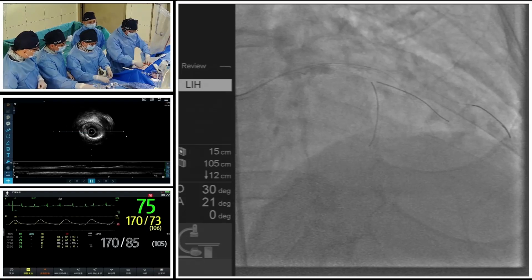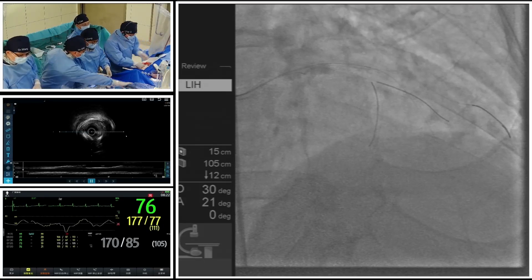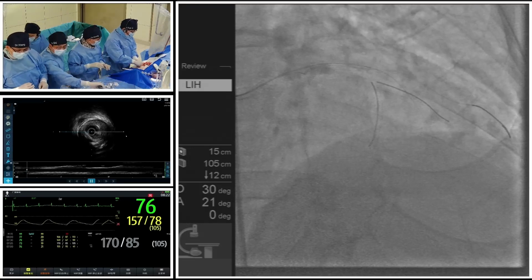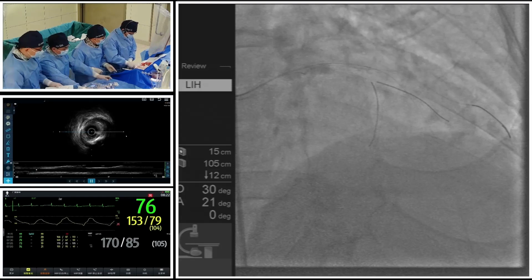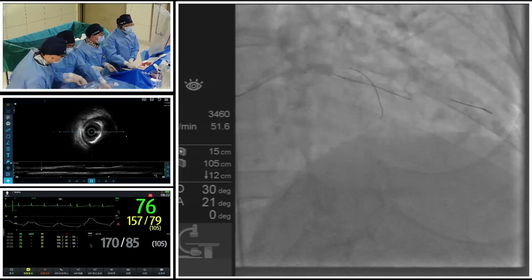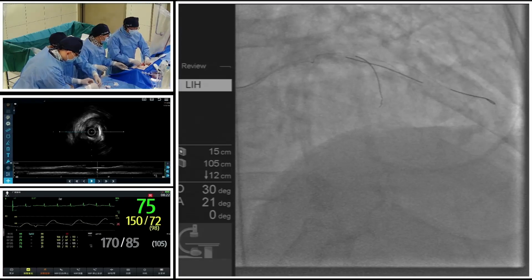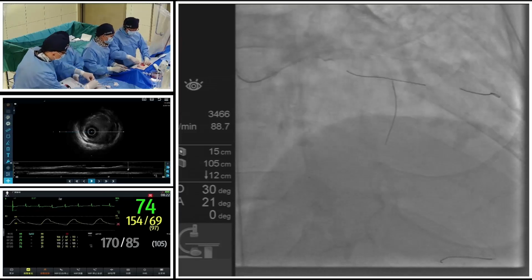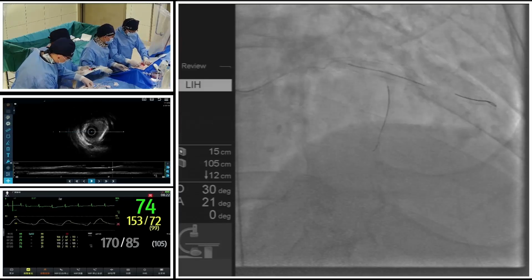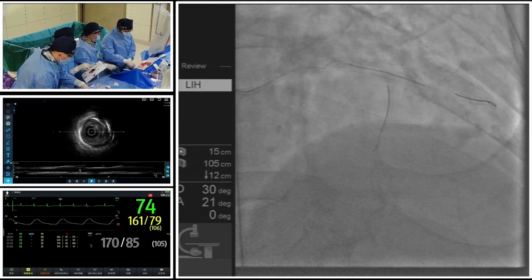So for the left main, I like to use a little bit larger shockwave balloon, 3.5. I think this makes sense because from the imaging system we checked, like I said, on the contrary side of the circumflex ostium, there is a very typical and very severe superficial calcification with the angle around 270.